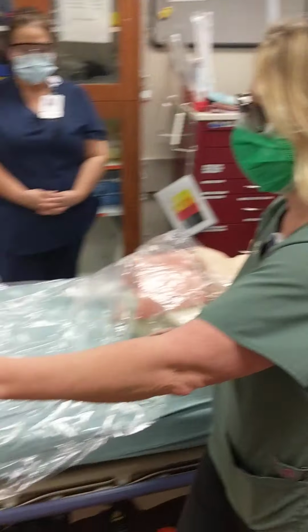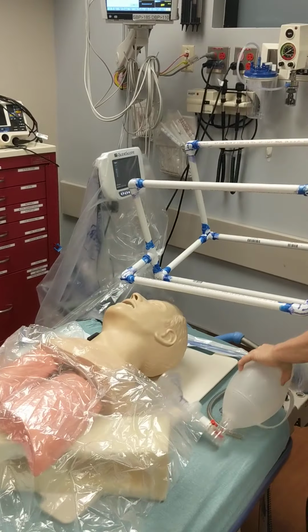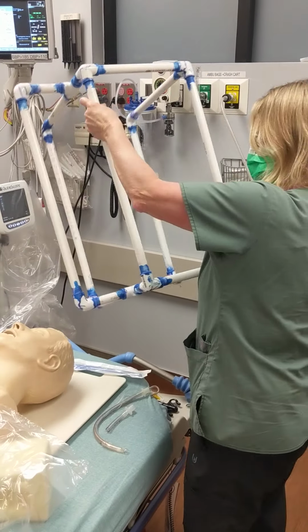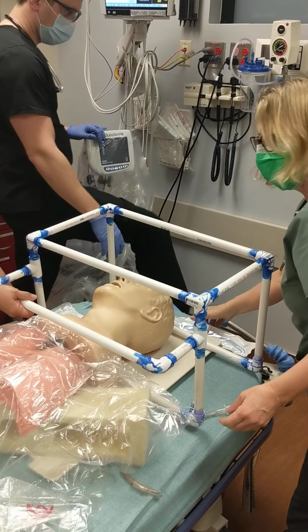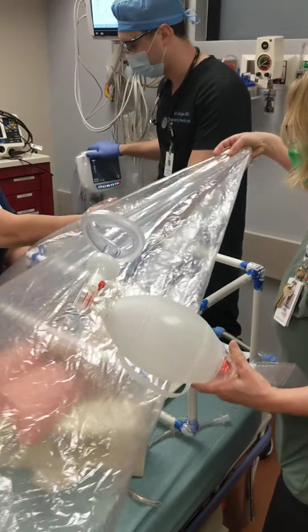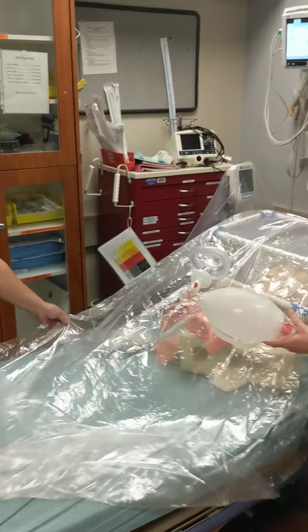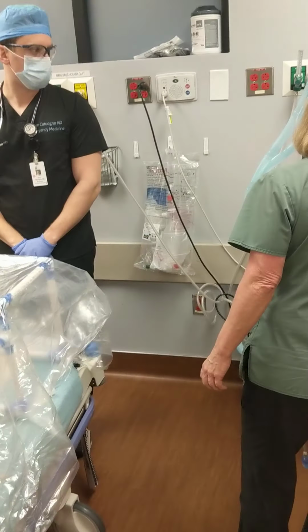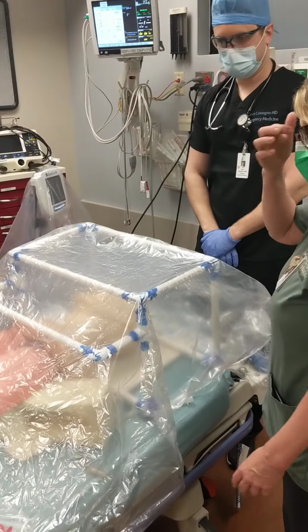We're going to get our frame and put it on our patient. Our actual frames will look a hair different, so it'll be easier to put on our patient. We won't have to lift their head. And now we can cover our head to protect everybody. If we want to hyperoxygenate, we can do that. And now we're ready to intubate.